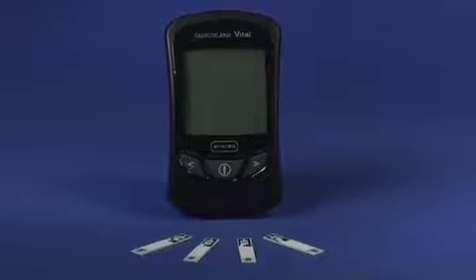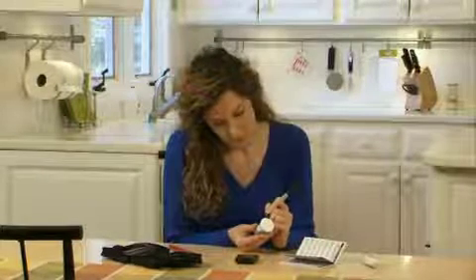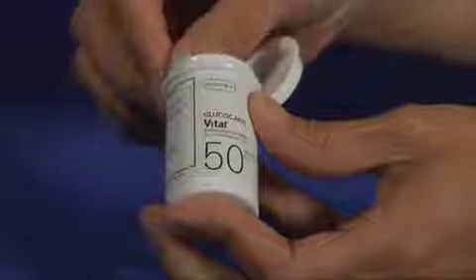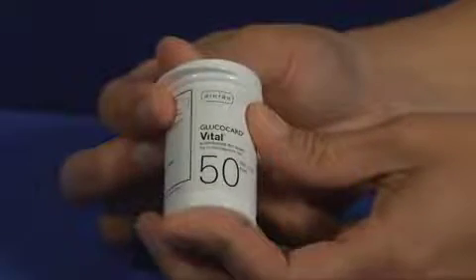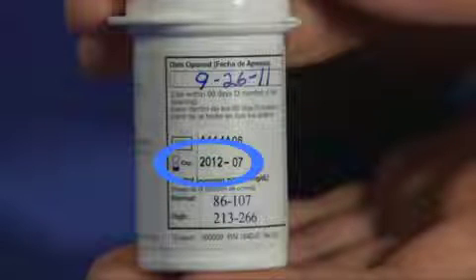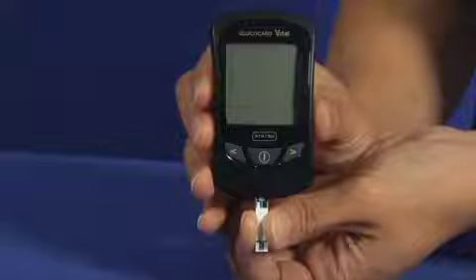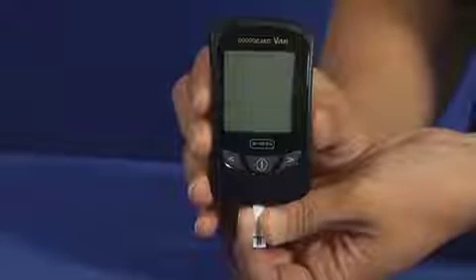Now you are ready to perform a blood glucose test. When opening a new bottle of test strips, always record the date the bottle was opened on the bottle label. Remove a Glucocard Vital Test Strip from the bottle and immediately close the cover. Be sure to check the expiration date of the strips and the date the bottle was first opened — test strips are good for 90 days after first opening. Insert a Glucocard Vital Test Strip into the meter with the contact bars first and the reaction site facing up. The meter will automatically turn on.